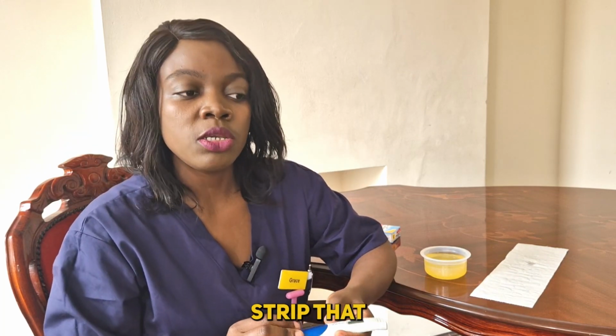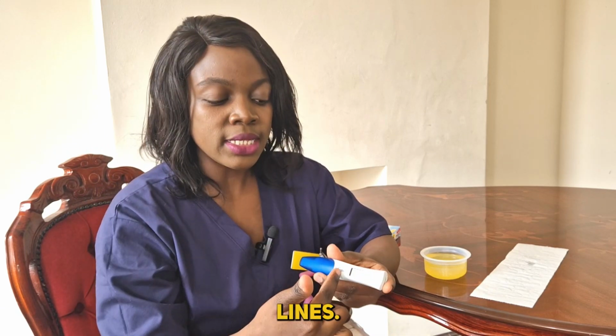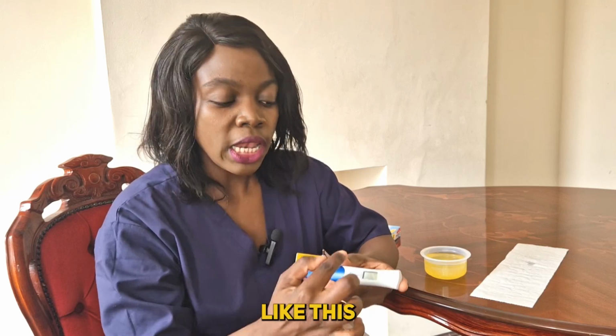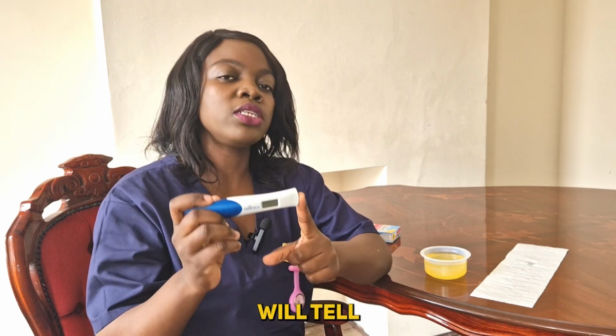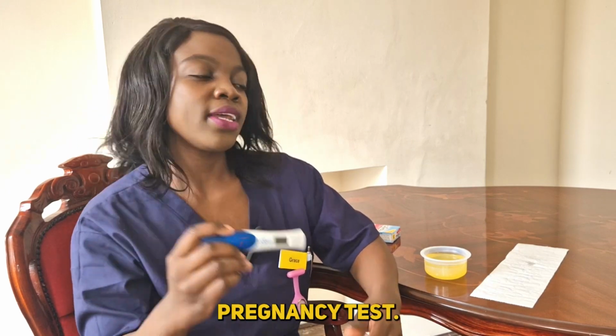But depending on the strip, there are people who use the small strips, which come with lines. It can show you what to look for, like this one will tell you if you're pregnant or not. There are also strips where, if there are 2 lines, it means you're pregnant. If it's 1, it means you're not pregnant. So just go by the instructions according to your strip. Mine will tell me not pregnant or pregnant. So that's how you do your pregnancy test.